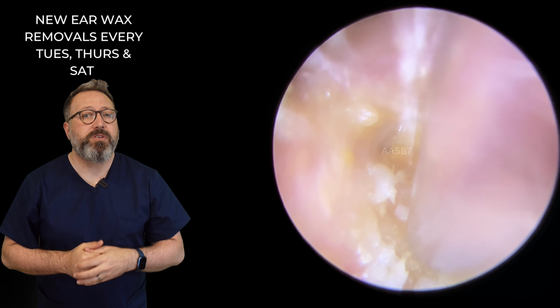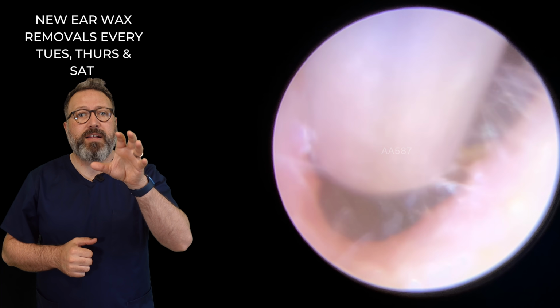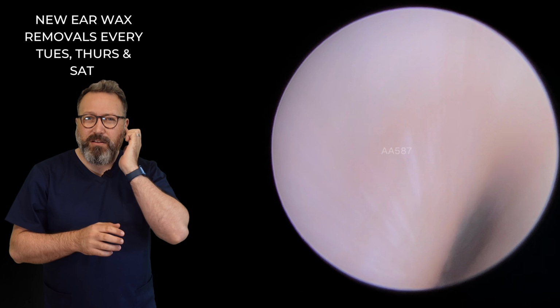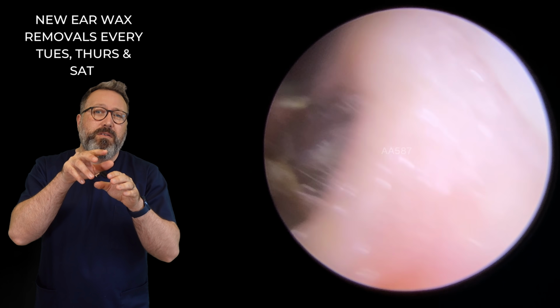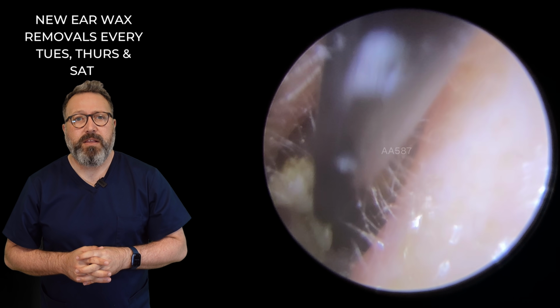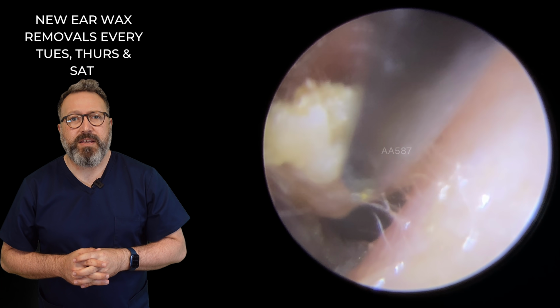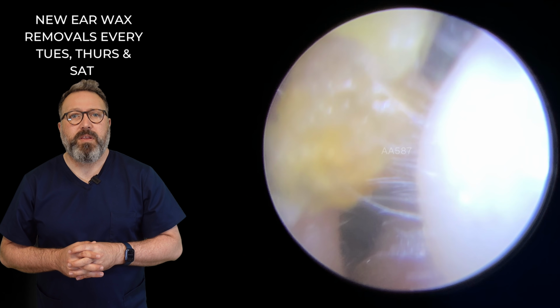You might miss those, so sometimes it's good just to tilt the endoscope down a little bit to have a look at them. So we've managed to get hold of that, bring it forwards. It's angular, it's a little cornflake basically. So we're going to go in with the crocodile forceps, clamp onto that, bring that out. There we go. There's a little bit of dead skin attached to the back end. You can see just there coming away. Brilliant.